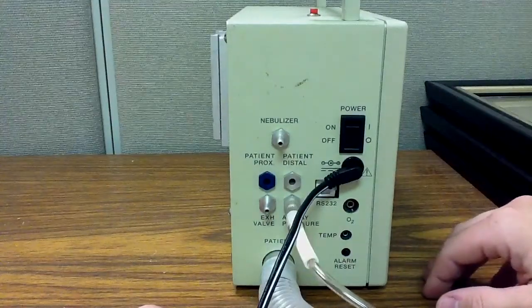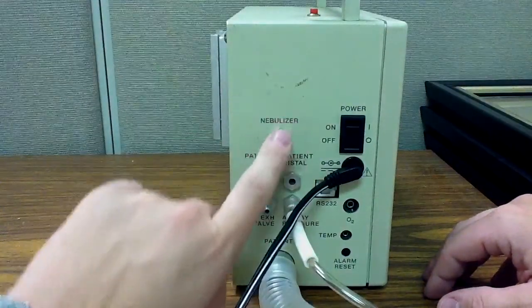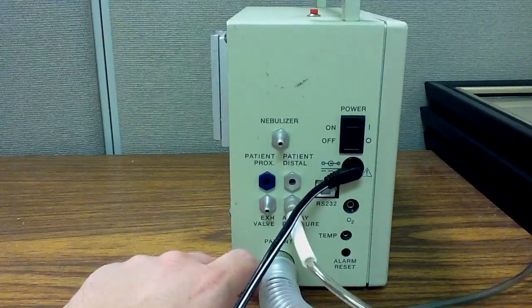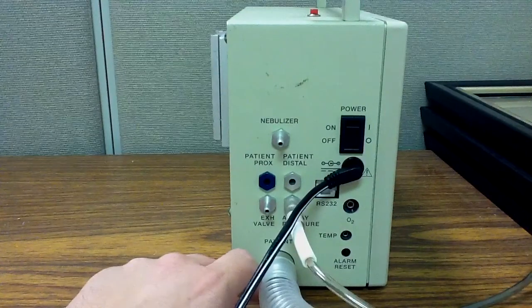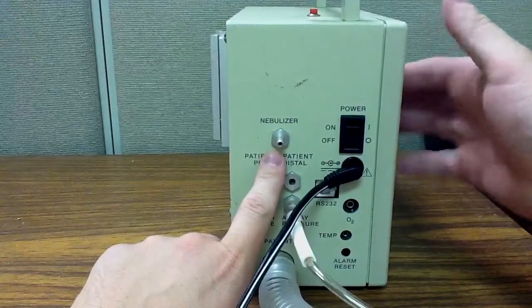Now, if you decide to do a nebulizer, if you need to give beta agonist to your patient, you can attach nebulizer tubing here. You can place your nebulizer in line in the ventilator circuit itself, preferably proximal to the patient. And I'll show you the nebulizer option in the ventilator.